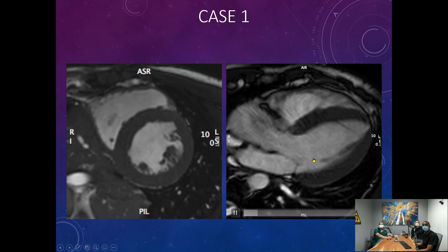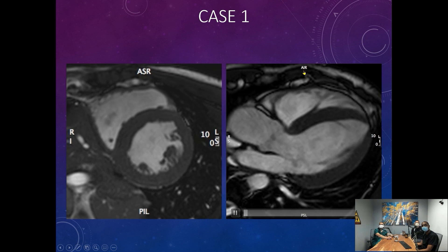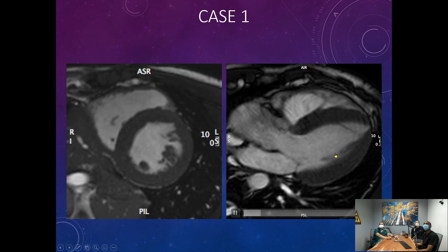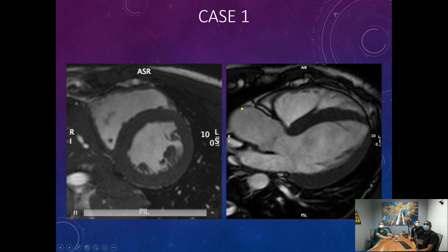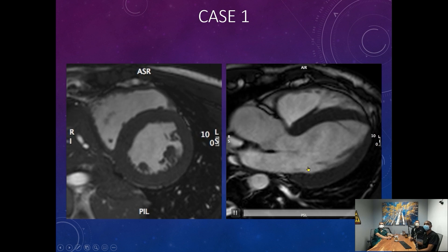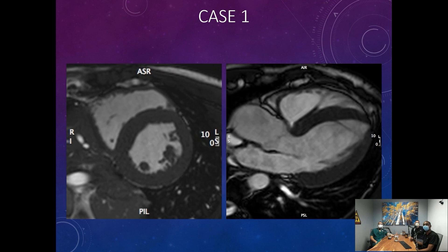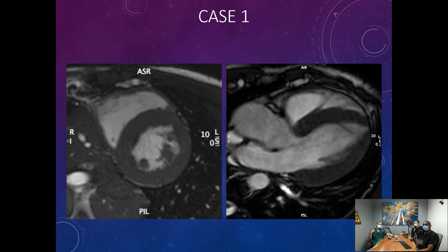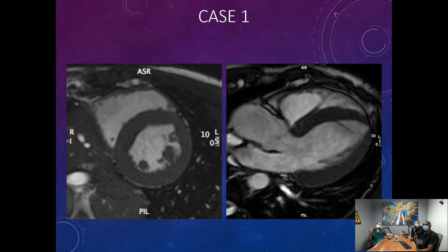On the right-hand panel this is a 90-degree view called the three-chamber view or long axis. The left panel is a cut at the papillary muscle level, and this view opens up the left ventricular cavity, still showing the front part of the right ventricle. We can see the aortic valve. Cine SSFP, because of its properties, is good to show blood flow within the heart.